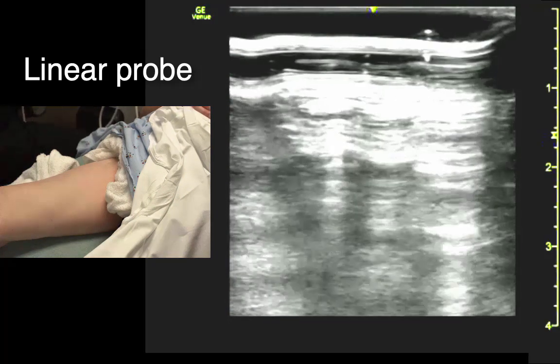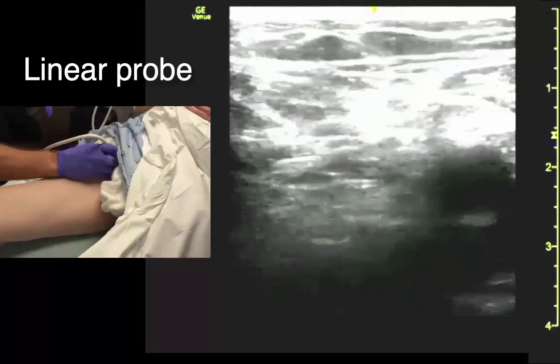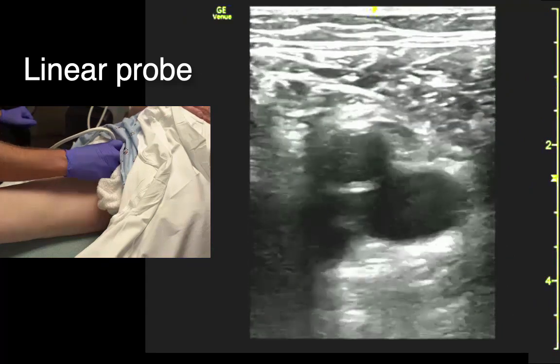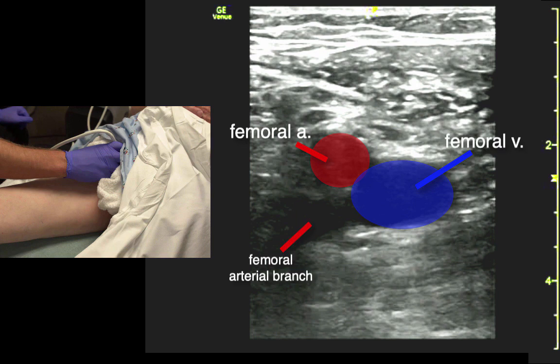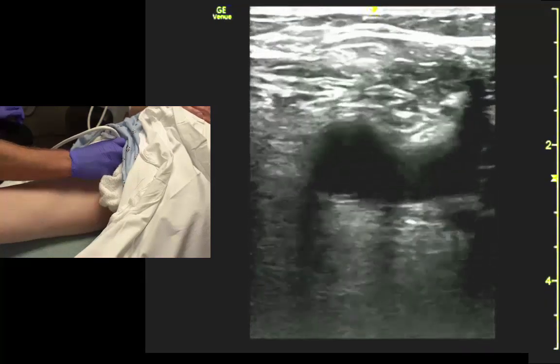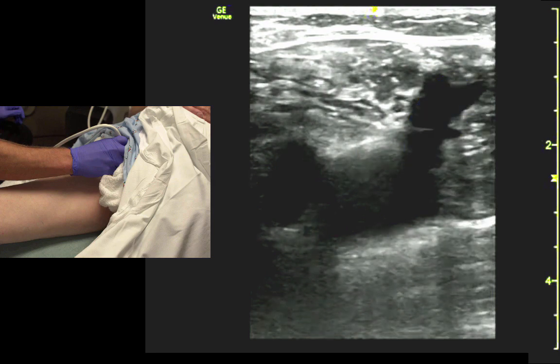Next up we're going to demonstrate on vessels. To look for the vessels, we start up high in the femoral crease, right about halfway between the ASIS and the pubic symphysis. When we first find the vessels, we see the artery and the vein — the vein's medial. If we track proximally, we should see the saphenous vein as it joins the femoral vein.